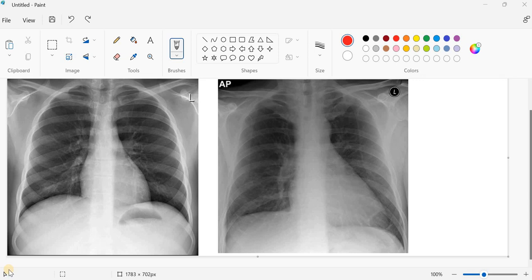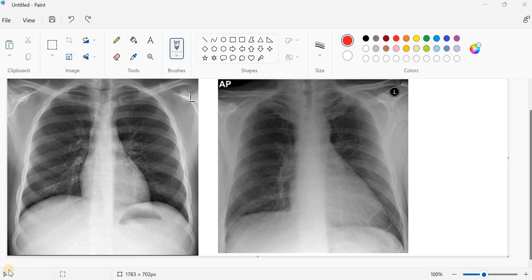Hello everyone, today we are talking about how to differentiate between the posterior anterior view and the anteroposterior view of the chest X-ray. Four points actually we should pay attention to whenever we are looking at X-ray to identify if it is posterior anterior or anteroposterior.